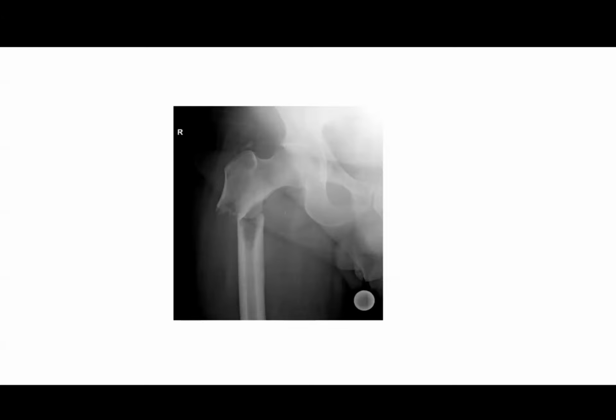You can describe more about the fractures. So you can say this is a transverse fracture with a varus deformity. This is the language. So if they heard this, they know you have been seeing this before. You have been on call before.